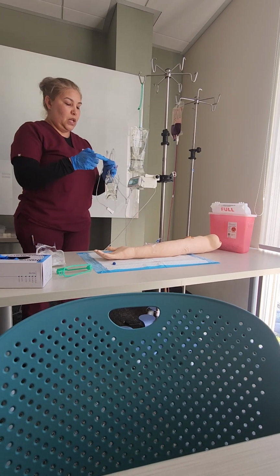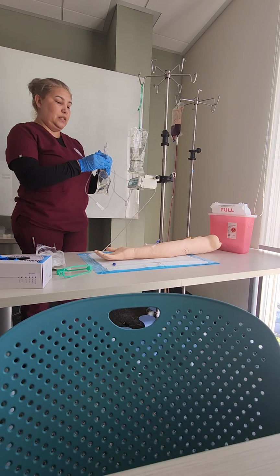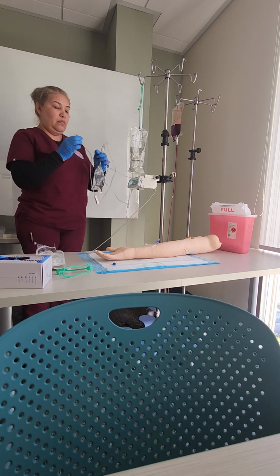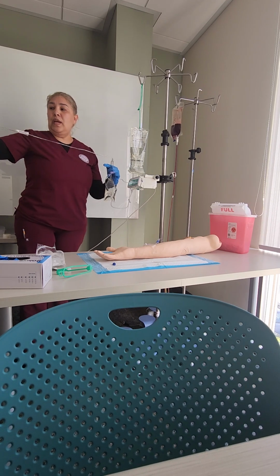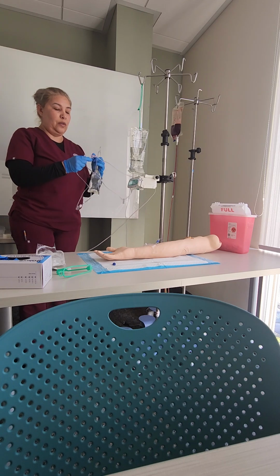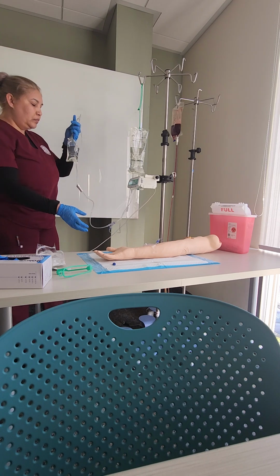Okay, so I want to clean the hub, 30 seconds. My tubing for my secondary is brand new, so it's got the cap. I will remove the cap, still fully sterile. I have cleaned the T. It's going in. Make sure it's fully in there, tight.